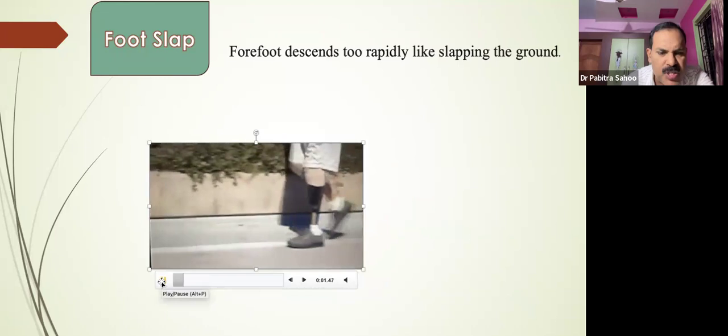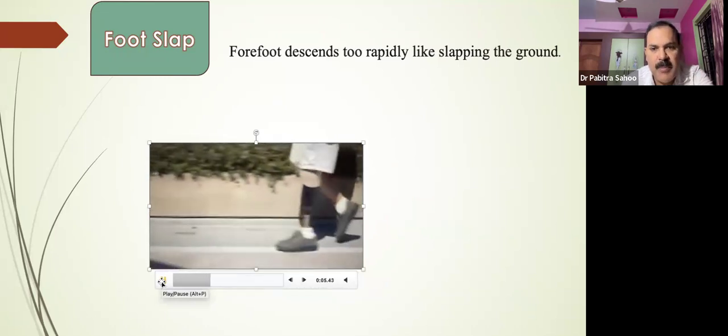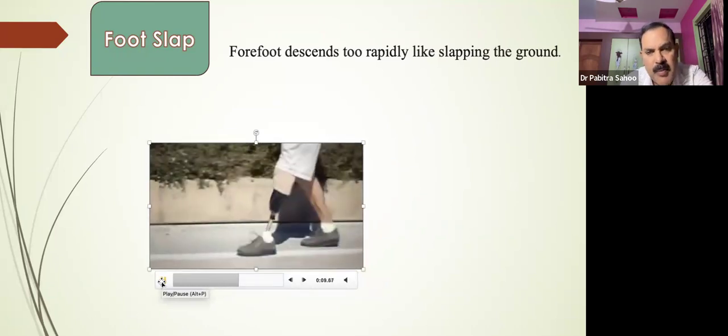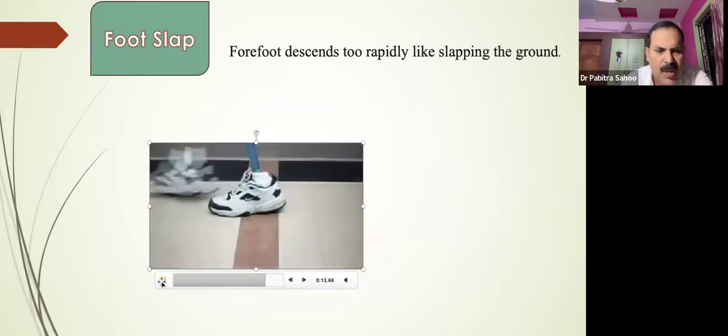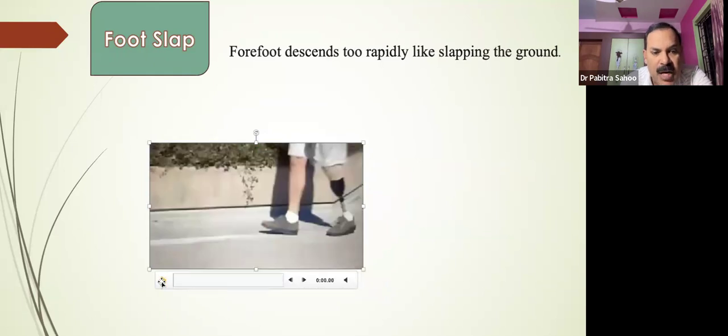What are the possible causes? If the plantar flexion resistance is too soft, or too hard, it affects the knee. If it is too soft, then instead of a gradual simulation of plantar flexion, all of a sudden there will be plantar flexion. Another cause is a heel lever arm that is too short, meaning the end of the prosthesis heel is close to the midpoint of the foot. Or the patient is driving the foot into a quick flat to assure extension of the knee.